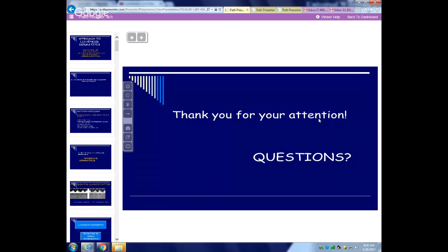If you don't want to import a PowerPoint, you can just import 10 slides of certain entities and then use that for your teaching. Or if you're self-learning, when you're reading a book, you can just open PathPresenter, search library, put in the diagnosis. So you're reading about, say, prostate today. You just click whatever diagnosis you are on, prostatic adenocarcinoma. So search library, put in the diagnosis, prostate adenocarcinoma. It will pull out like 15 cases actually. And then you can look at the cases while reading. So it makes it a good correlation for your reading actually.